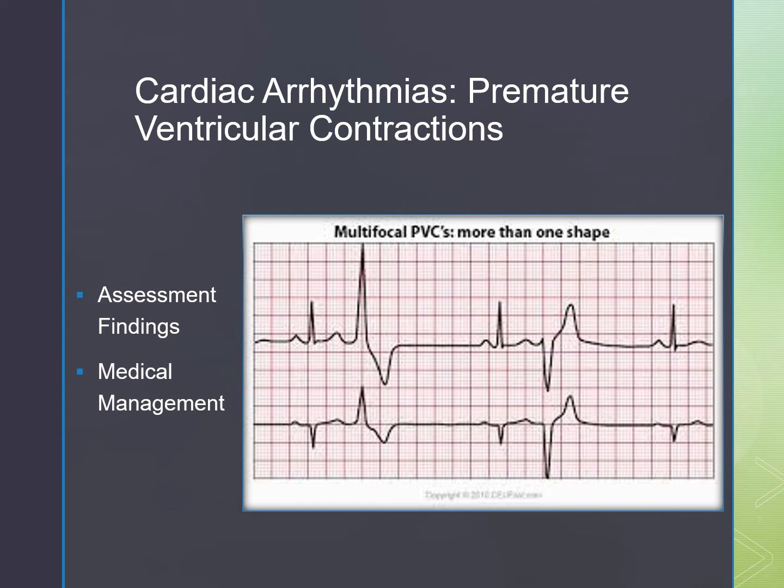Premature ventricular contractions, or PVCs, is a ventricular contraction that occurs early and independently in the cardiac cycle before the SA node initiates an electrical impulse. So no P wave will precede that wide, bizarre-looking QRS complex.